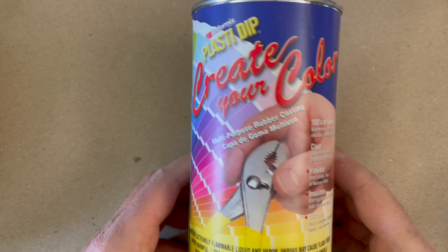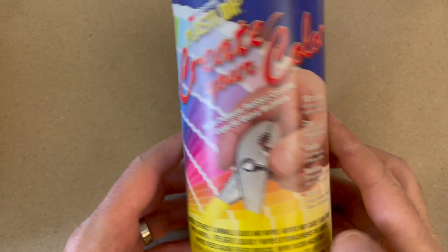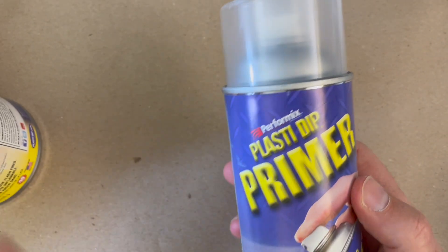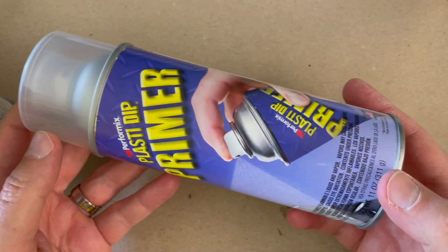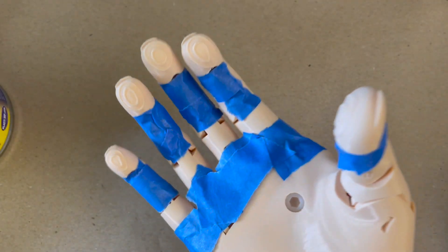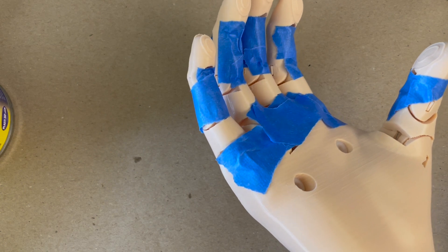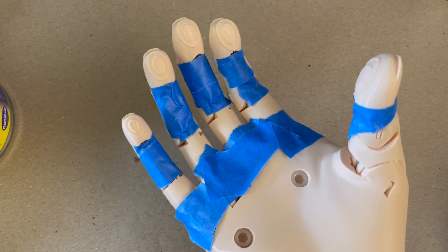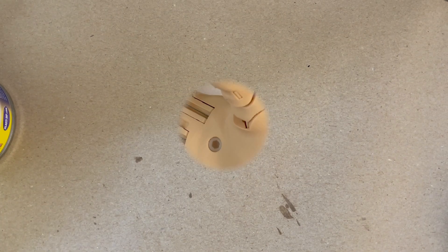Now we're going to put Plasti-Dip on the hand. I use Clear Plasti-Dip and treat the hand with the primer first. Without the primer, I found the Plasti-Dip can wear off fairly quickly. I cover up the strings with a little bit of blue tape, since the primer may be acetone-based and might damage or weaken the strings. I'm going to go outside where it's nice and airy to spray this.